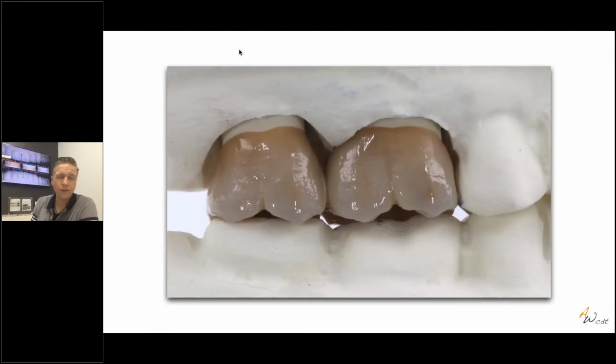That's something very typical, where almost everything started: the single, basically full contour Zirconia posterior crowns. And you can tell these look a little bit more opaque. They are not layered. They're full contour Zirconia. There used to be Zolids, and Zolid already gave us a nice aesthetic, and they look nice. I mean, there's nothing wrong with that, but I'm pretty sure we can do better.